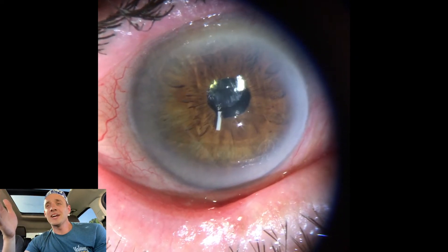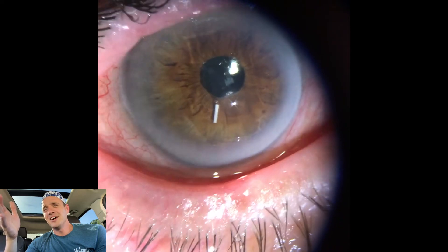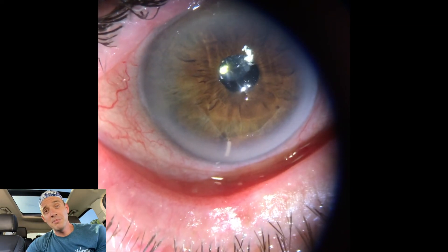This is too cool, and check it out. In the end, it's right there — six o'clock, in the angle, beautifully placed. It's too good, it's too good. One in a million shot, doc. One in a million shot — Seinfeld reference.